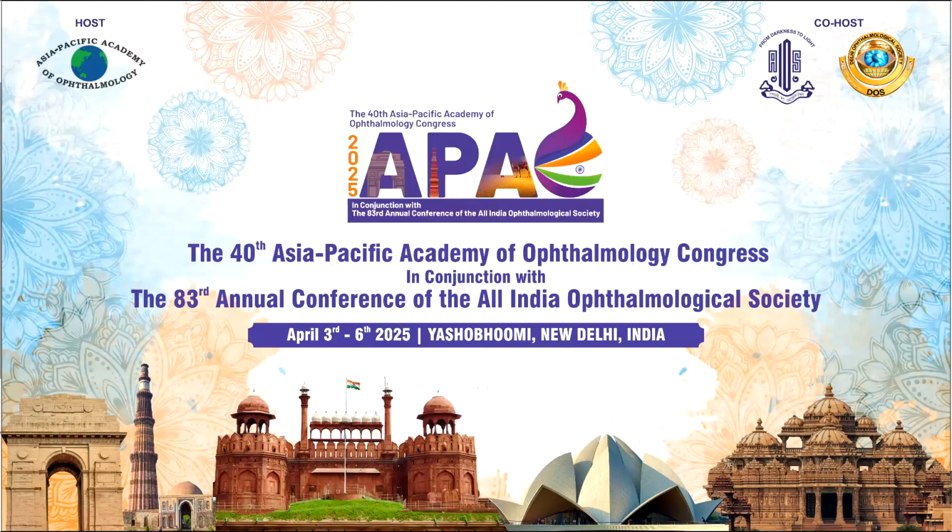This is a good question. When we look at the lens as an experienced surgeon, we will know whether it is at least a diffractive lens or an EDOF lens. Most are diffractive only. In any case, the most important thing is whether they are happy with the vision. If they are happy, then if it is a diffractive lens, I will do a diffractive trifocal for the patient, depending on the price point they want. If they don't want to spend much, we can give an Indian-origin trifocal, or if they want to spend more, you can do a premium trifocal lens.